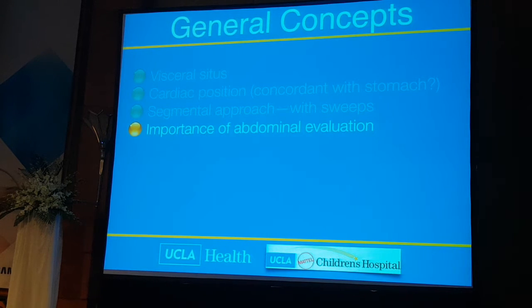It's very important to look in the abdomen. Not so much to see the spleen, although some of you may be able to see a spleen, I cannot, but certainly to look at the stomach, the descending aorta, IVC, and maybe azygos.